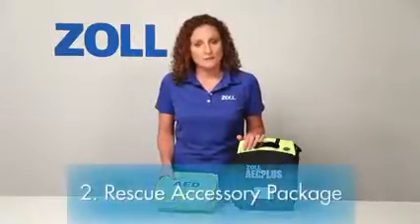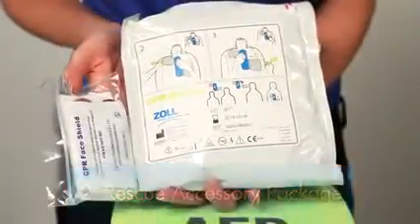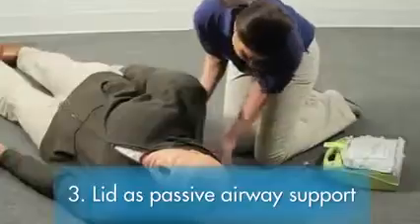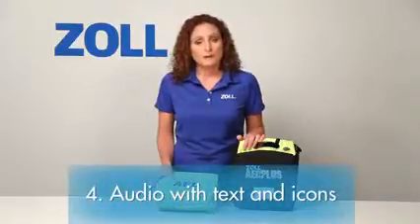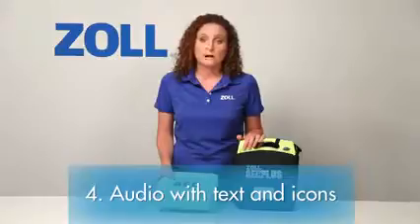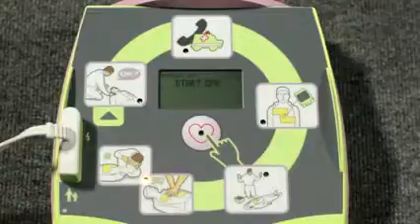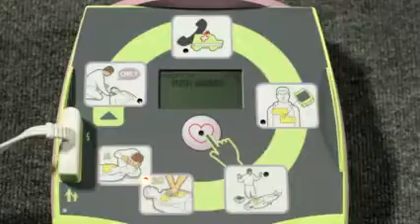The second element of best support: every CPR-D pad has a rescue accessory package attached. The third element: the lid of the AED Plus can be used as a passive airway support system to maintain the victim's open airway — a resuscitated victim may not breathe freely without this sort of support. The fourth element: most other AEDs do little more than provide audio prompts to guide the rescuer. The AED Plus also provides parallel text prompts and a graphical icon with flashing light for each audio prompt, so rescuers are guided by both what they hear and what they see.